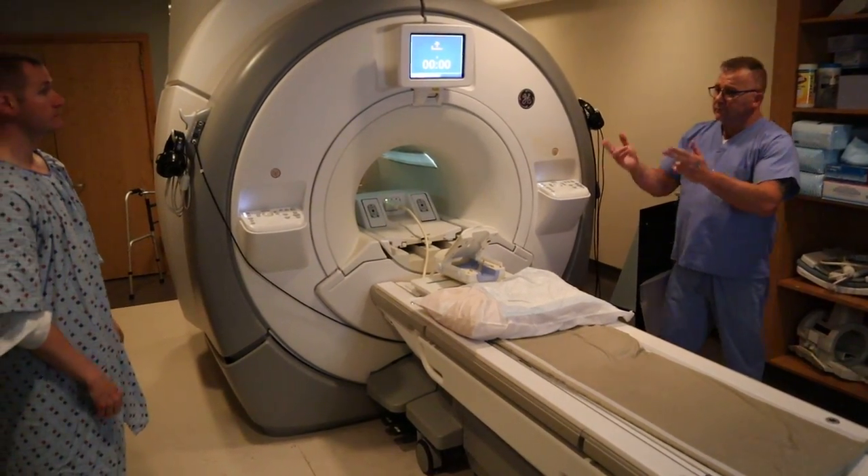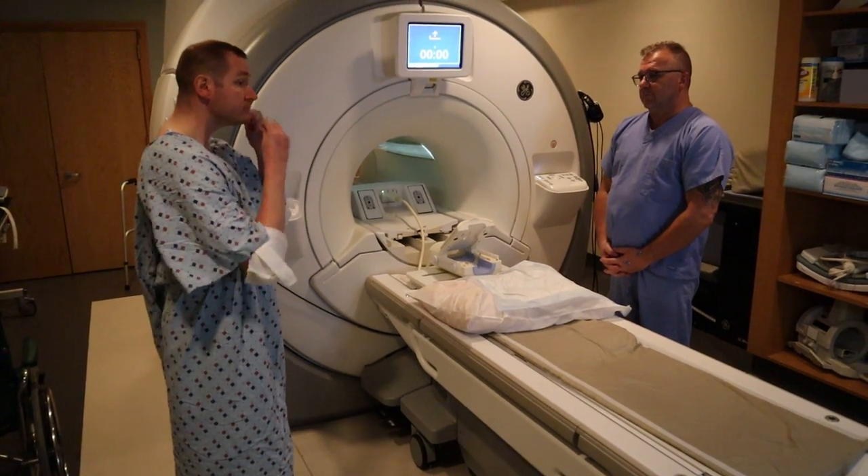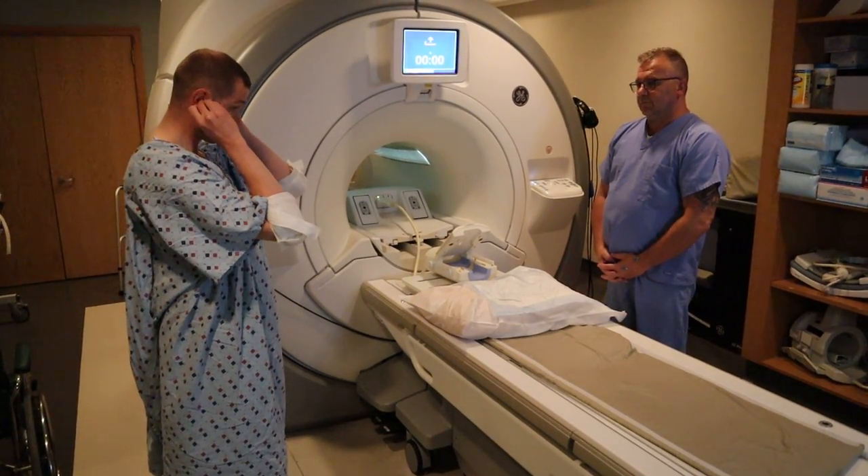We're now going to scan an MRI of the wrist. We always instruct the patient to insert earplugs before laying down.